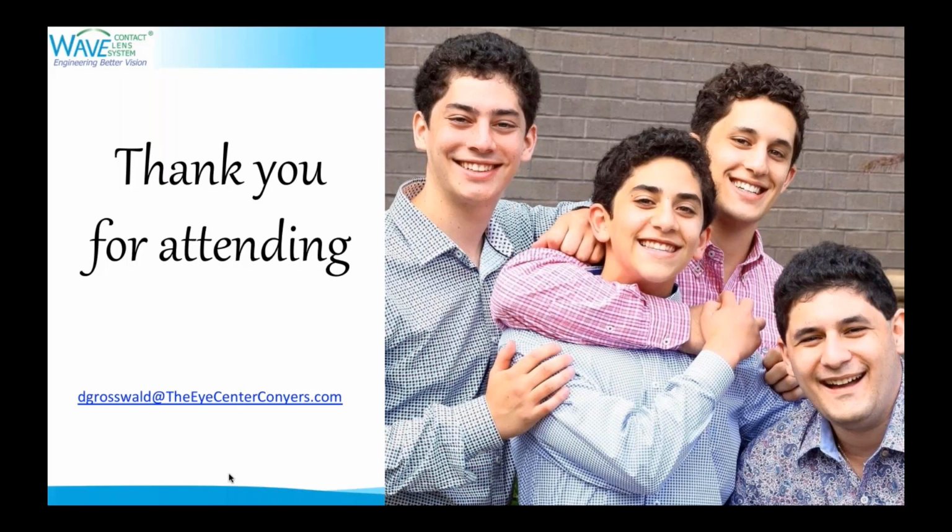So what I was about to get at is that Dr. Sent, who designed the iPrint Pro and has much more knowledge in this area, insists that you must stay out of the lens for 48 hours. But again, the sclera is very forgiving, and these are not patients with tube shunts and things like that. So we're having success just having them stay out of the lens for an hour, but if you want to do it right, have them stay out of the lens the day before, 2 days before.